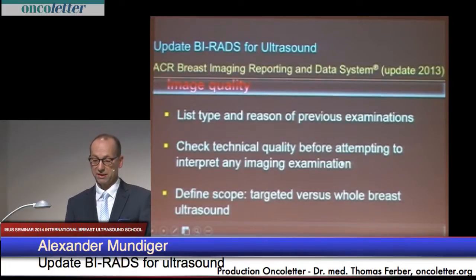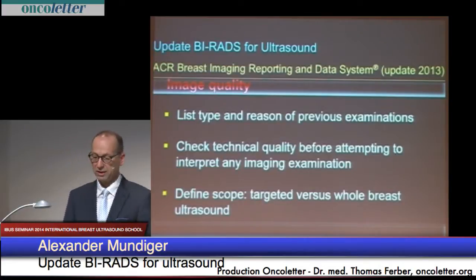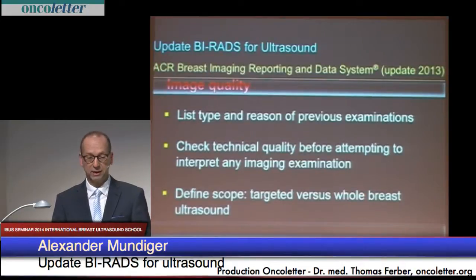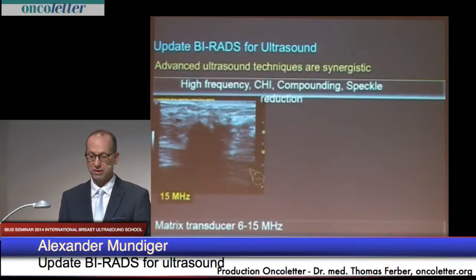If you're looking at image quality, this is also a new issue in the update of BI-RADS. You should always list the type and the reason of the previous examinations. Then you should check for technical quality before attempting to interpret any imaging examination. And finally, you should define the scope of your examination. Is it targeted or is it whole breast ultrasound?